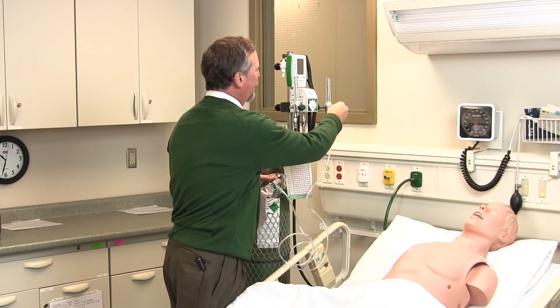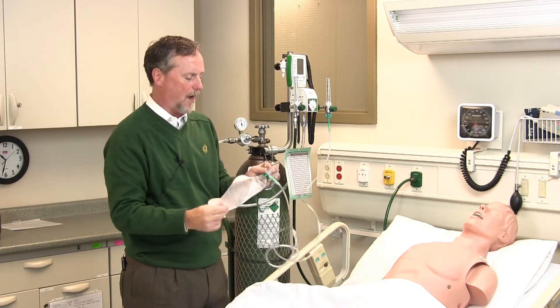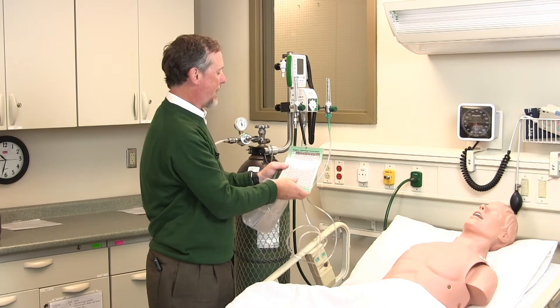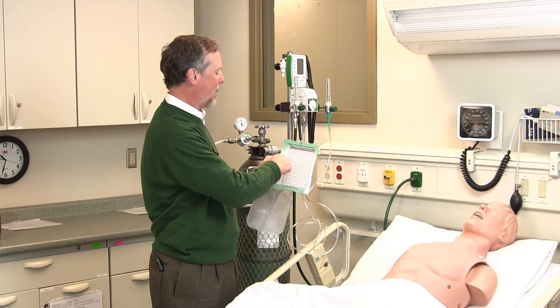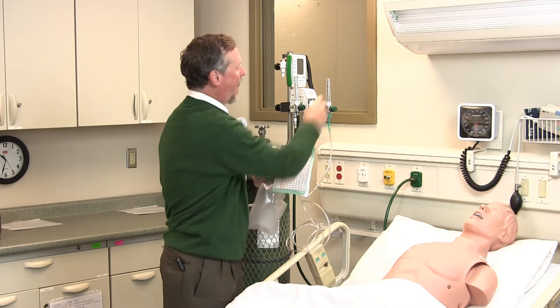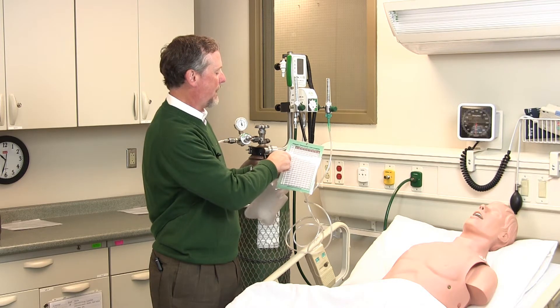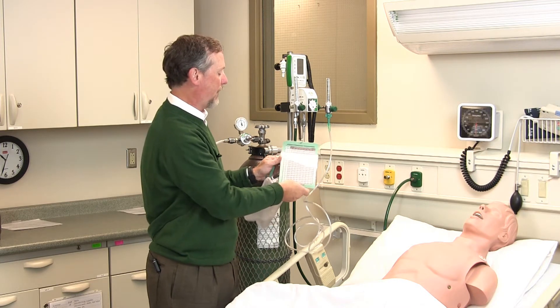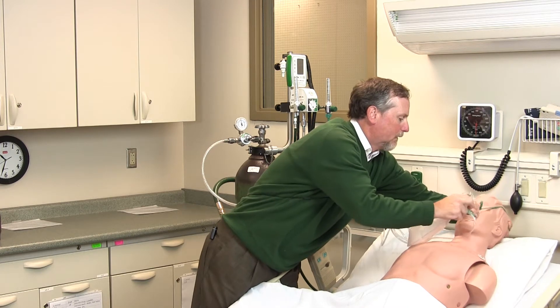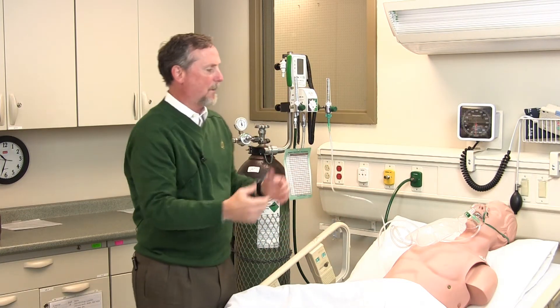So we have this patient requiring 40% oxygen, and we'll turn on our flow meter and start flow. Where do we start flow, and what's the correct flow for Heliox? Typically, a non-rebreather will be run at about 15 liters per minute. Looking at our chart, 15 liters per minute total flow at 40% requires about 10 liters dialed in on the flow meter. We fill up the non-rebreather, place it on the patient, and from there we can start monitoring the patient's breathing.